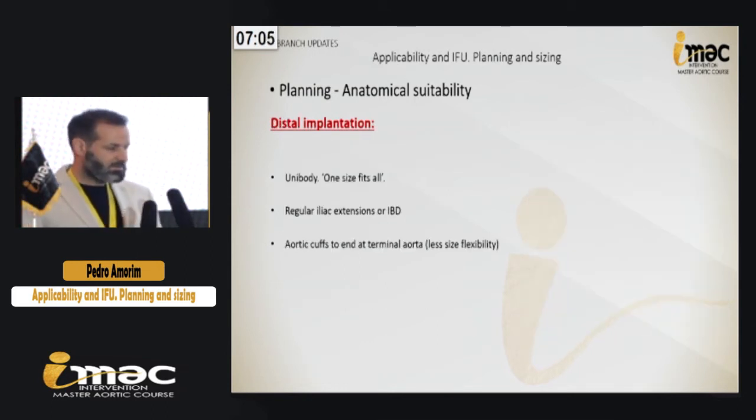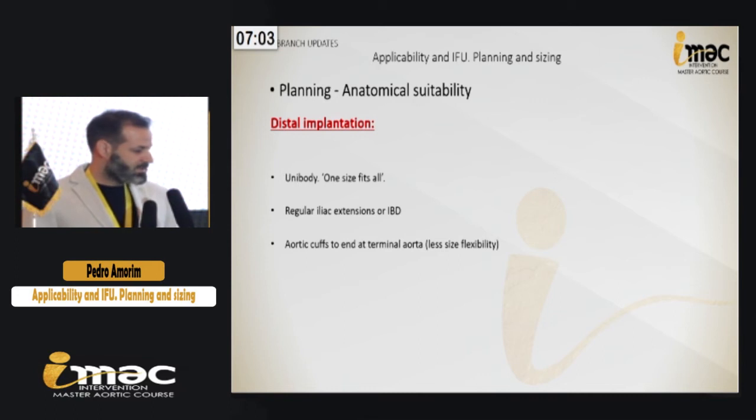Distal implantation is, like always, a unibody, one size fits all, and then we extend with regular extensions or IBD or whatever. If we can, we end at the aorta, but the solutions are not very much at our disposition.